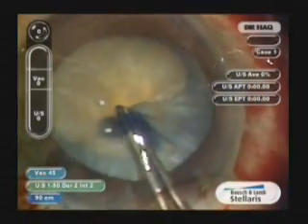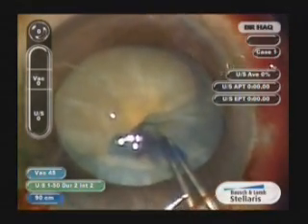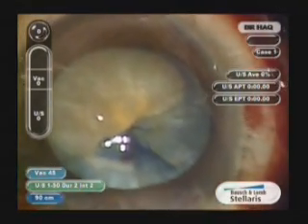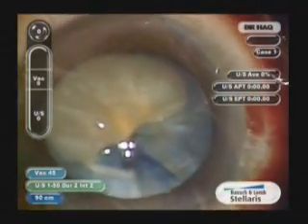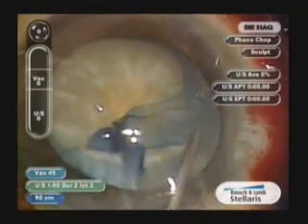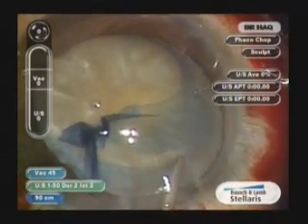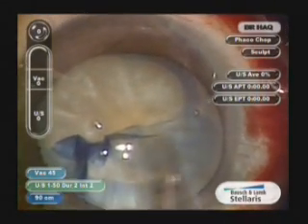The tear is tending to go out again, so it is important to refill the anterior chamber because by this time some of the viscoelastic has leaked out. It is very important in these cases to keep a tense, full anterior chamber with viscoelastic, and then grab as close to the tear juncture as possible.